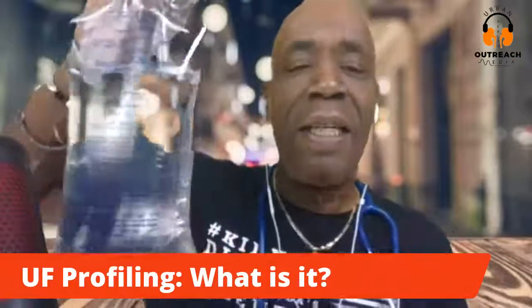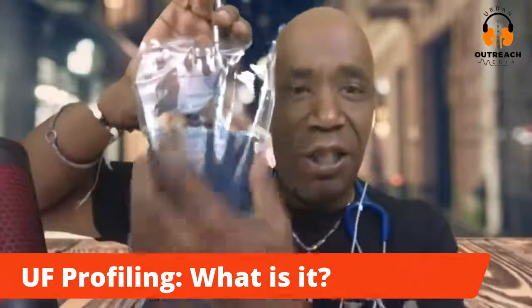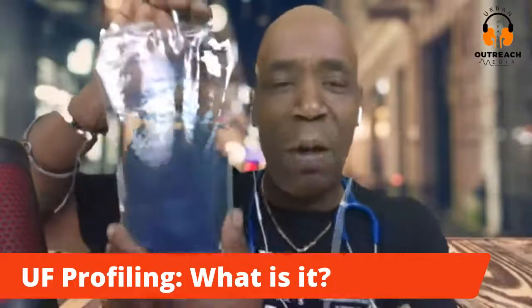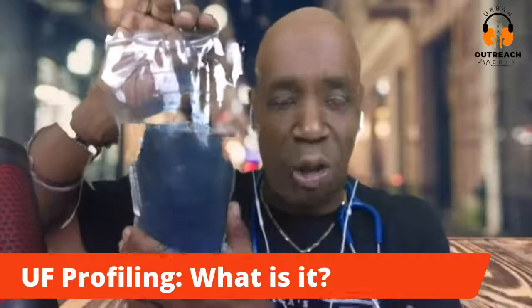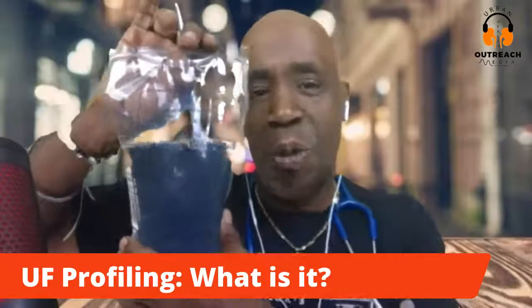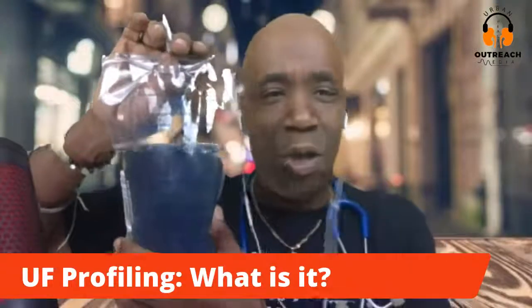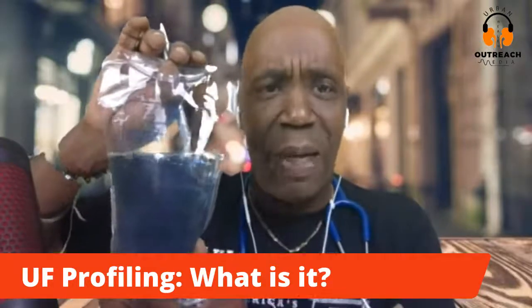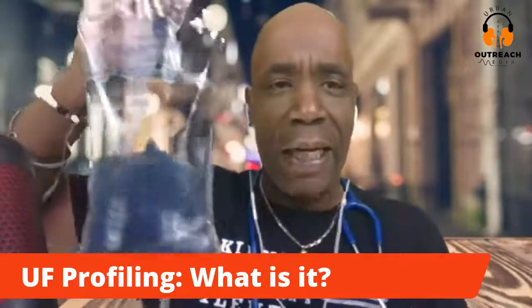If you're cramping, do not tell them not to give you saline, because saline has the sodium that will stop the cramping. Don't be no hero and say you're trying to pull off the fluid and you've got too much on. You may need to adjust your dry weight. If you haven't been getting down to your dry weight and you're coming in 2.5, 3, 3.5 over, and you haven't been making it down because you've been cramping, don't try to be no hero, okay? Your dry weight has probably increased, especially if you've been eating three squares a day or your appetite has increased. Again, normal saline, 0.9% sodium chloride.